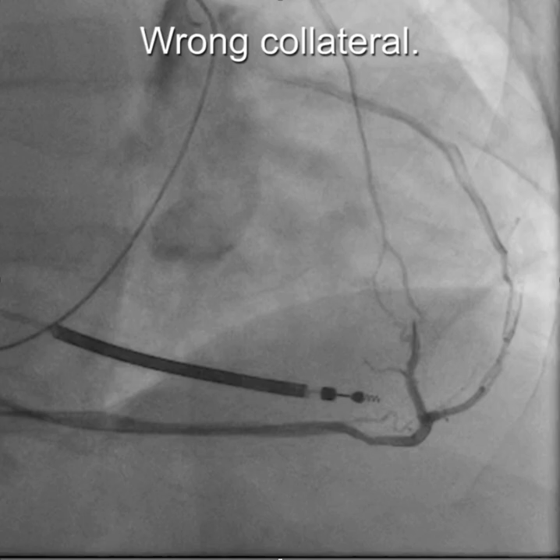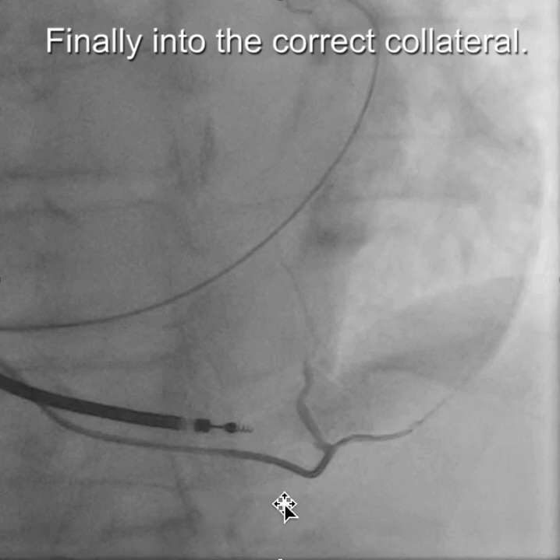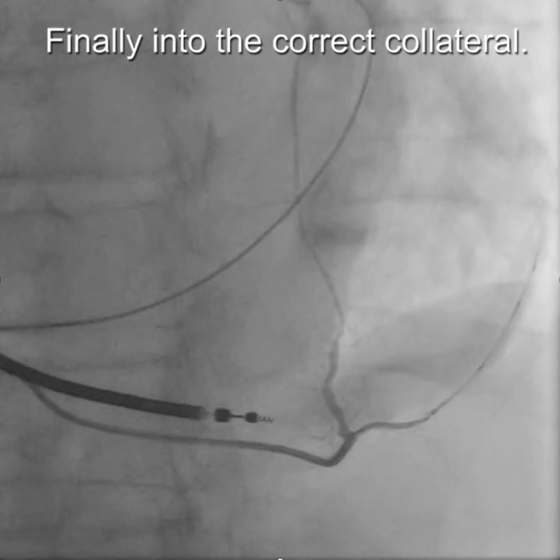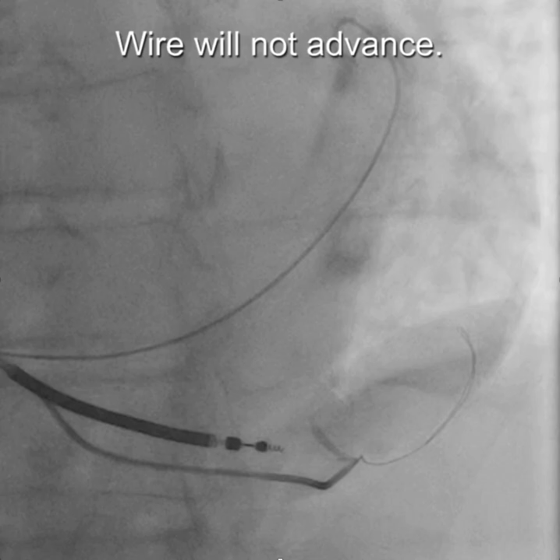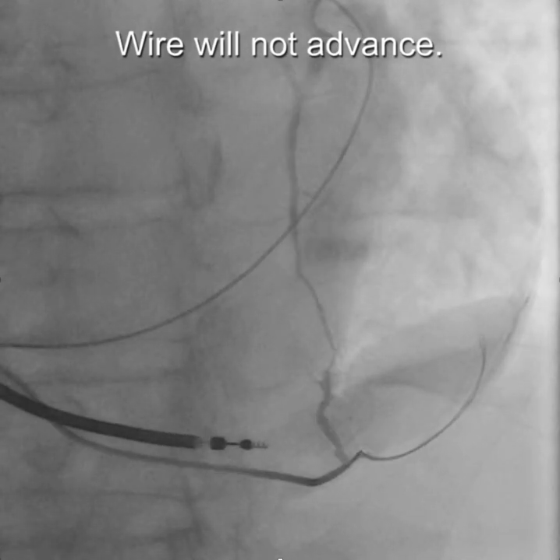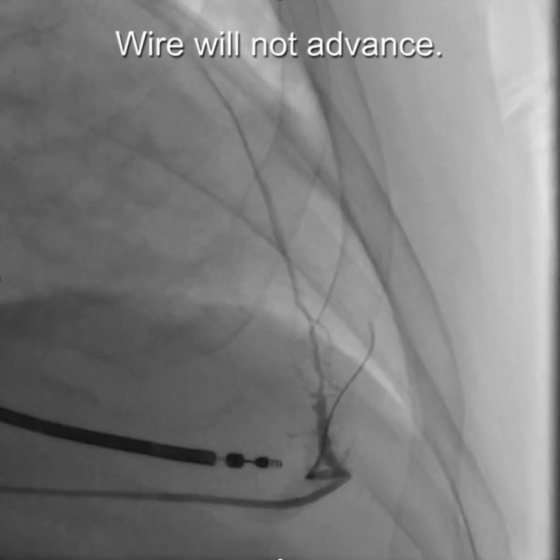As you can see here, we have the wire in the wrong collateral. With some catheter manipulation and trying a few fresh wires, we were eventually able to get a wire into the collateral leading to the target vein. However, the wire would not advance any further.